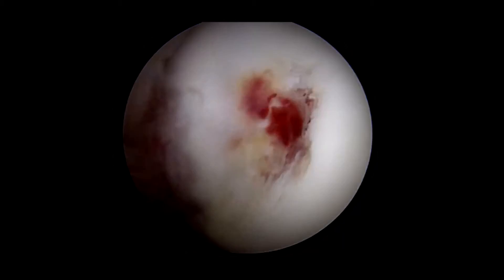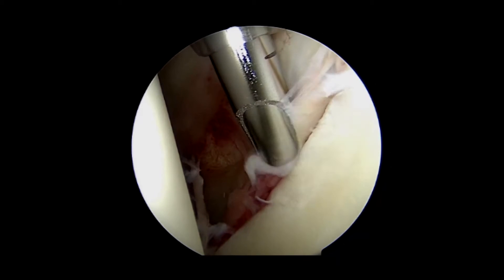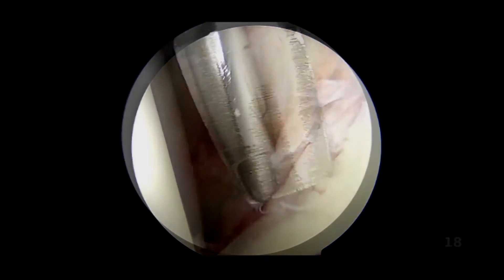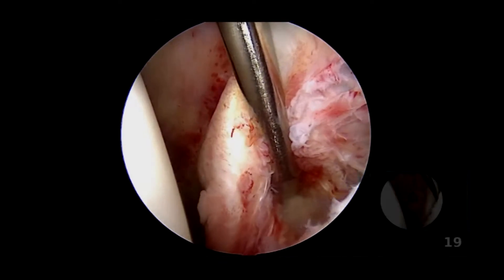The superior posterior portion of the humeral head is evaluated for a Hill-Sachs lesion. The frayed edges of the anterior inferior labrum are debrided with an oscillating shaver, and then a periosteal elevator is used to mobilize the capsulolabral tissue.